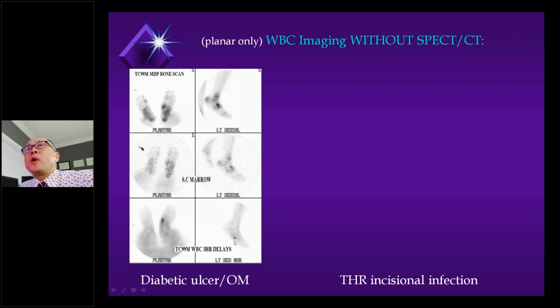Bone, marrow, white cell, we are, just intuitively, reasonably confident in saying that has to be within bone. It's way too deep to be just superficial.